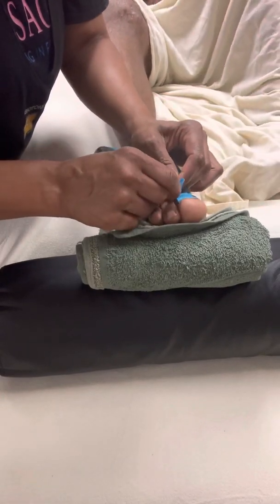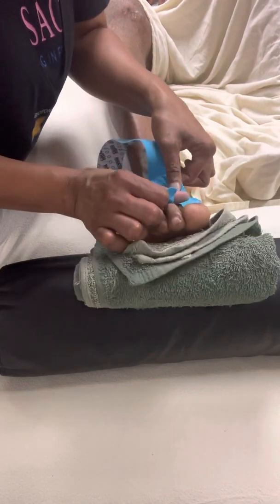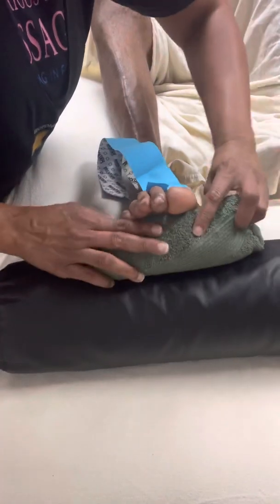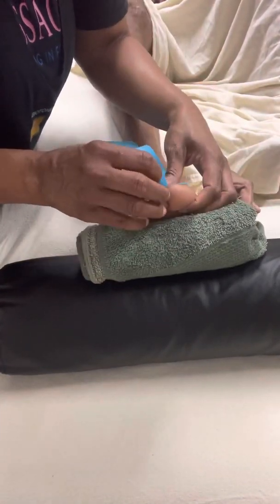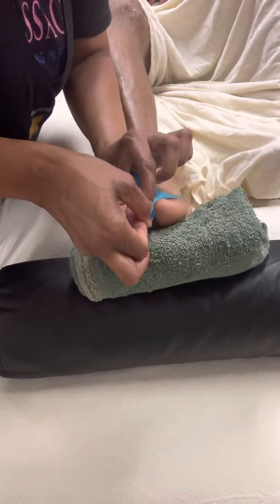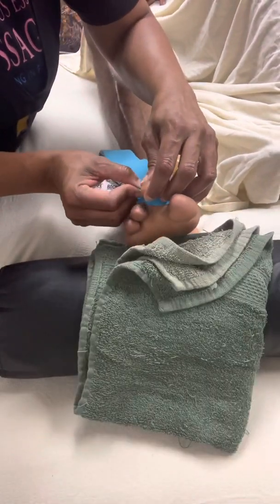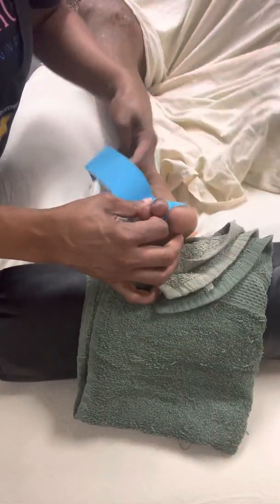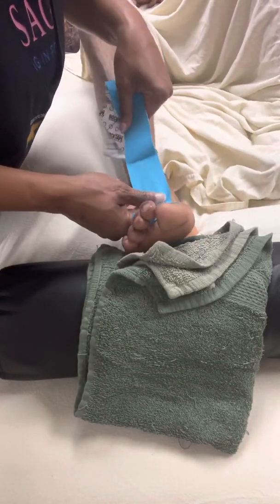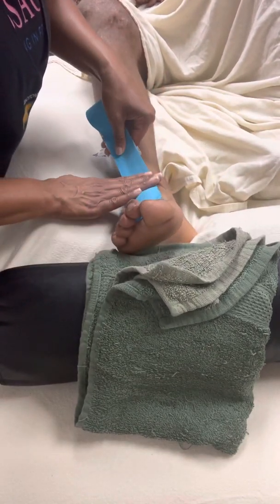I'm going to pull this back just a little bit here. Then I'm going to take this part of the tape and wrap it around these two toes here underneath like this. Then I'm going to take the rest of the tape and get it straight, and I'm going to pull it out a hundred percent.